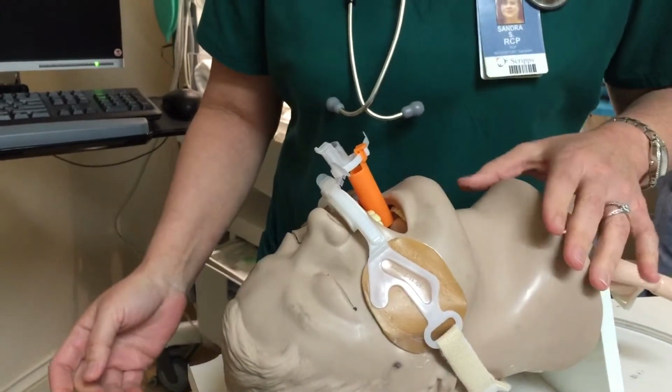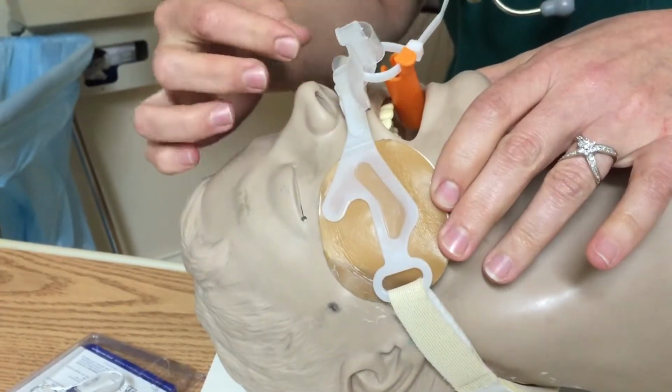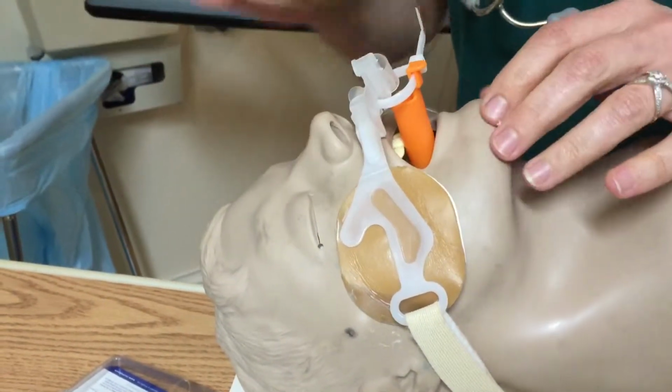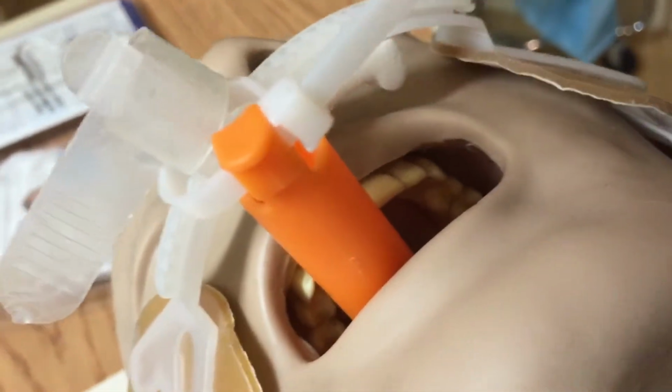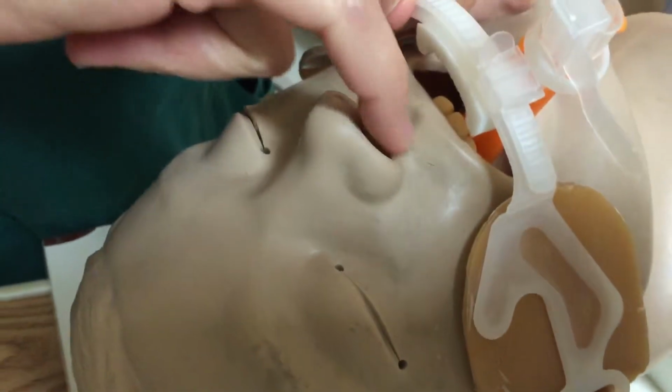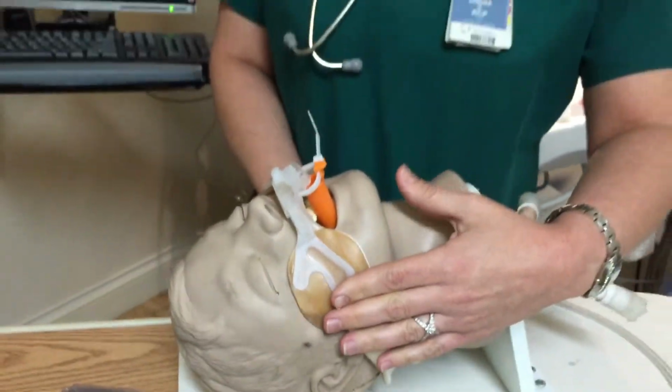Every time we do oral care, we're going to be moving the tube either to the right, center, to the left. Good place to check for any ulcerations is on the lips, on the bridge of the nose, in this area is where a lot of the ulcers occur. Now remember, not all patients are going to be indicated to be using the Hollister. So those patients that do not have the Hollister or will not be using the Hollister, we're going to be taping them. So remember that we change the tape on these patients once a shift.